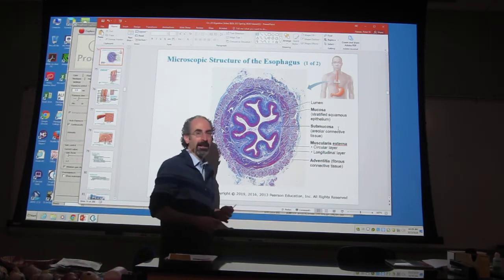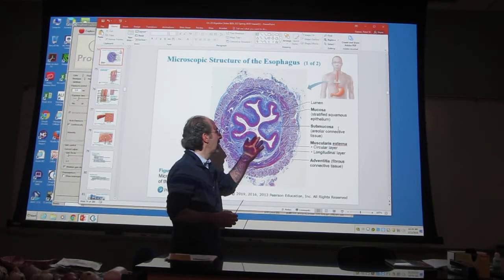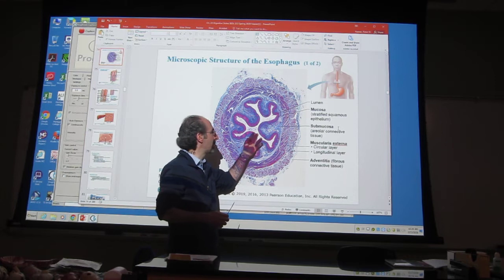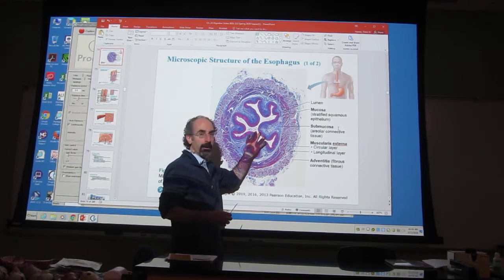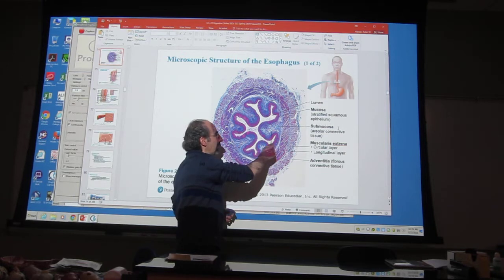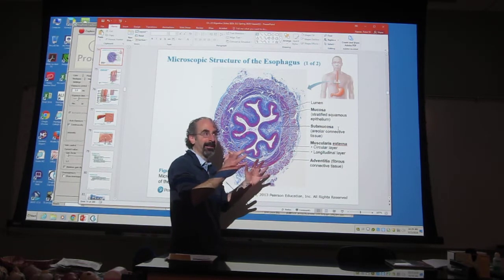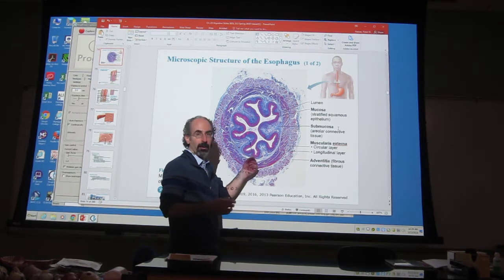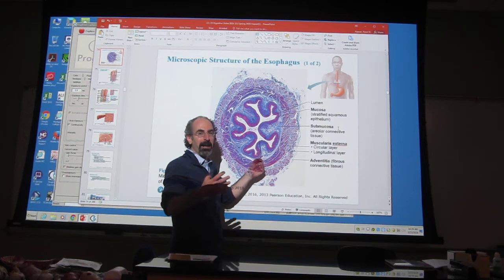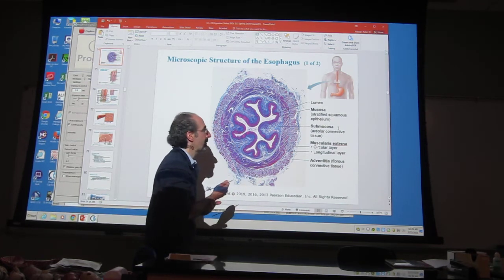The esophagus gets no such frills or luxury. It basically spends its life collapsed, and in fact, it helps you to stay in a collapsed state because when food goes through it, that food pushes the wall of the epithelium and also the other layers out of the way. It distorts them and bends them out, and that allows you to send signals to your brain and other parts of your GI that, hey, wake up guys, food is coming down, and stimulates things like peristalsis.